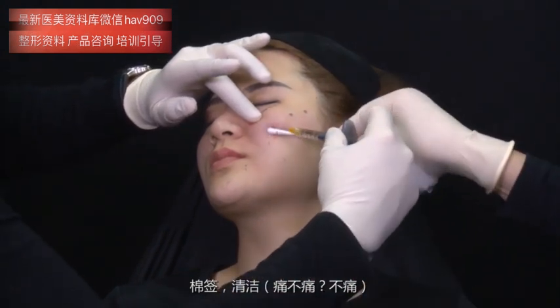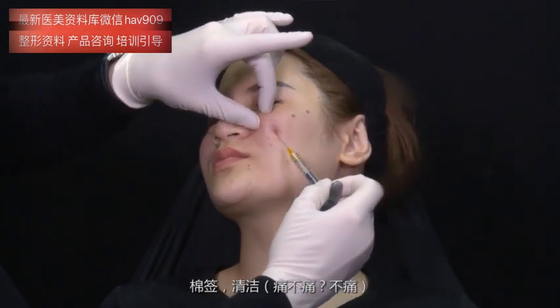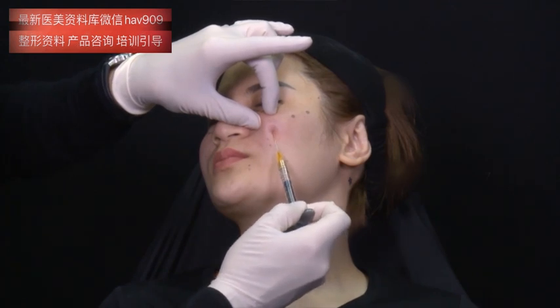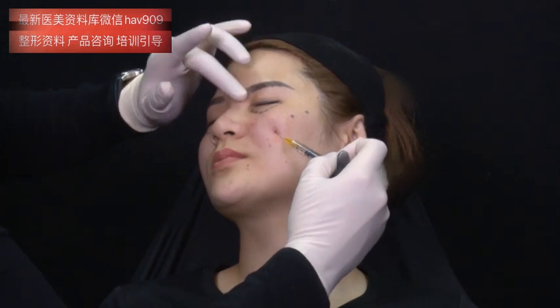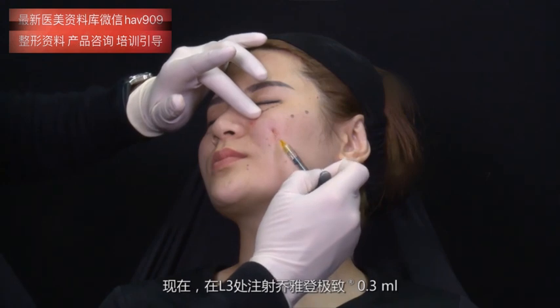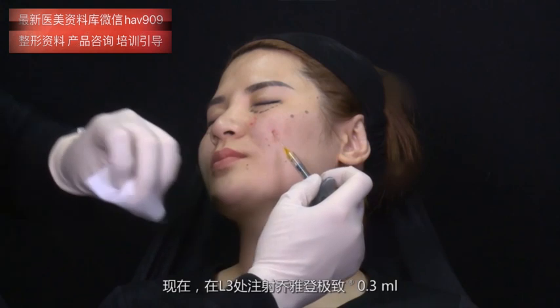Clean. Excellent. Now I'm injecting Ultra Plus, total of 0.3 in L3.